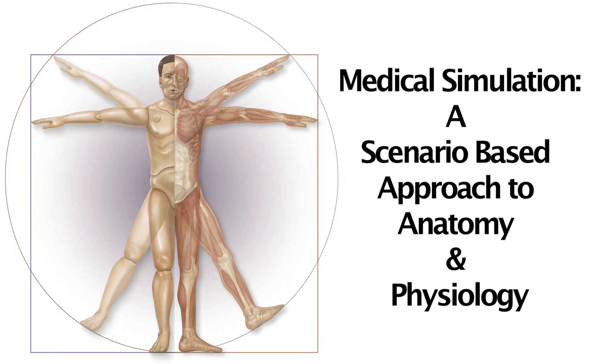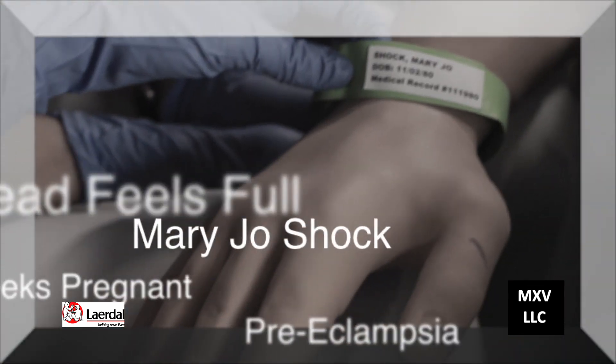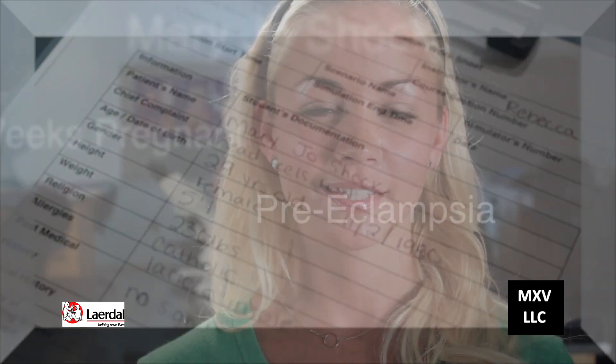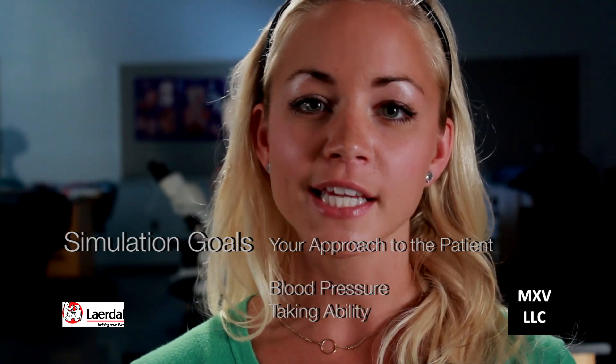Welcome to the video supplement for McGraw-Hill's Medical Simulation. Today our scenario is 'My Head Feels Full.' Our patient, Mary Jo Schock, is 33 weeks pregnant and suffers from preeclampsia. The objective in this scenario is to detect high blood pressure in a preeclamptic patient. The goals for the simulation include your approach to a patient as well as the skill of taking a blood pressure.